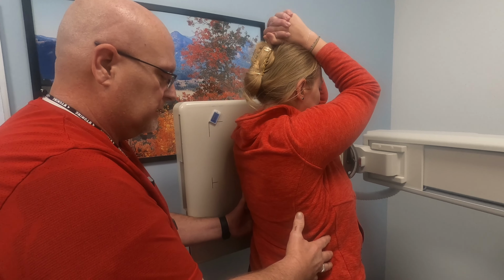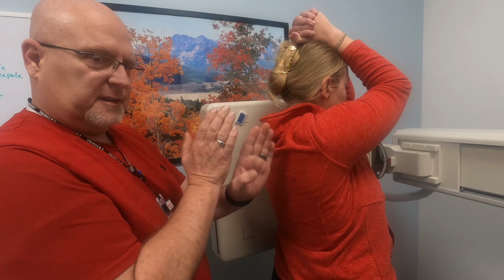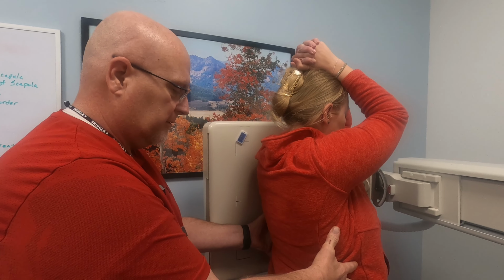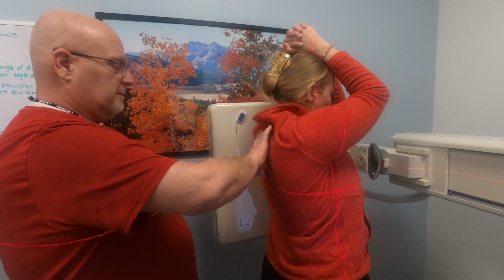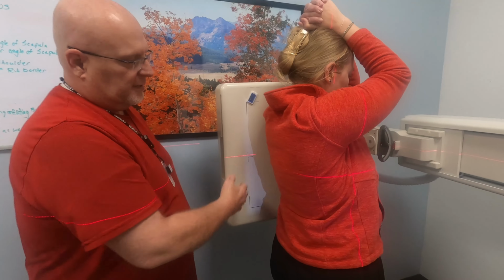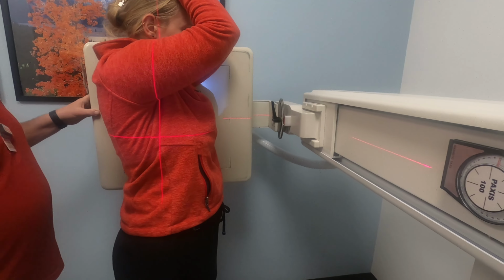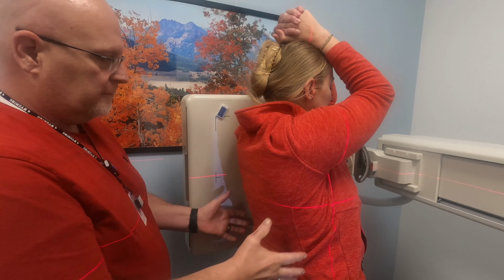So when we get our picture exposed, we're going to have our posterior ribs stacked on top of each other. Okay, and that's what you're looking for. And you can tell whether that's perpendicular or not. Central ray wise, again, we're going to be at T7. Okay, we've got 1.5 inches of light behind the back. We also have light at the front, okay? And we've got light above the shoulders as well, okay?